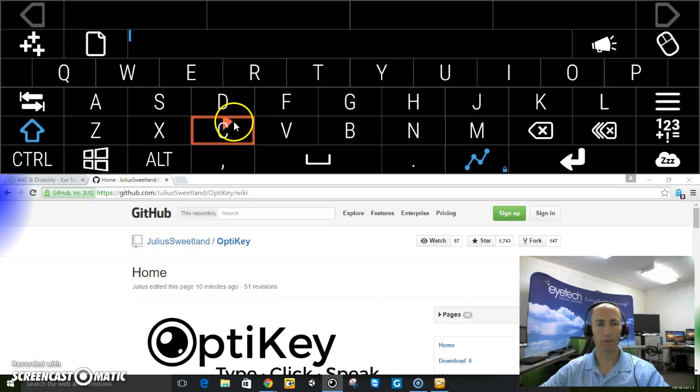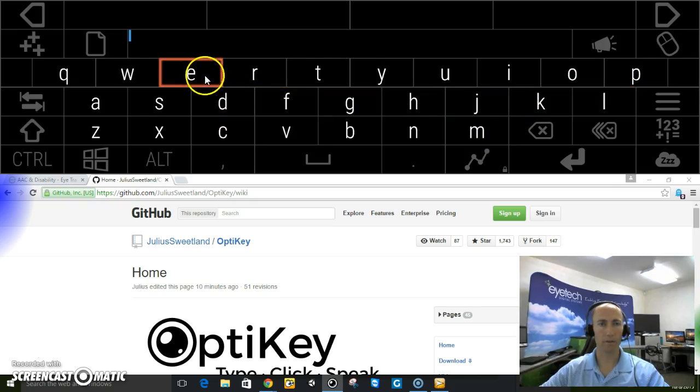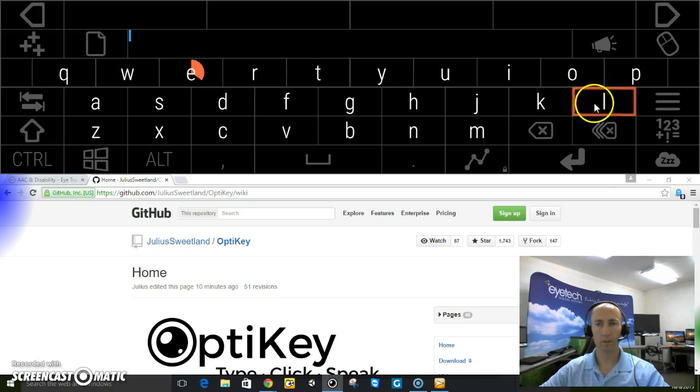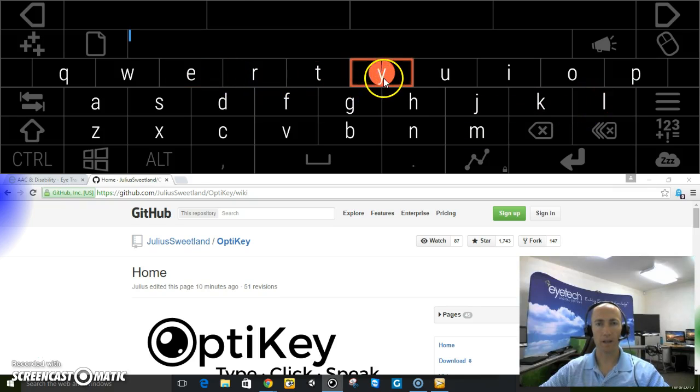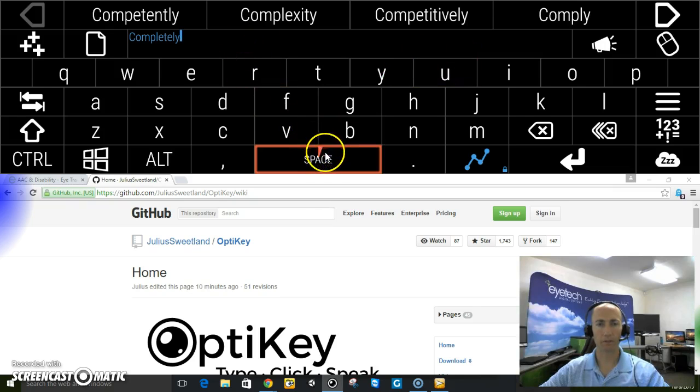this is how it works. You select the first letter and then look over all the other letters after that and then select the last letter. So completely is just in a couple clicks.